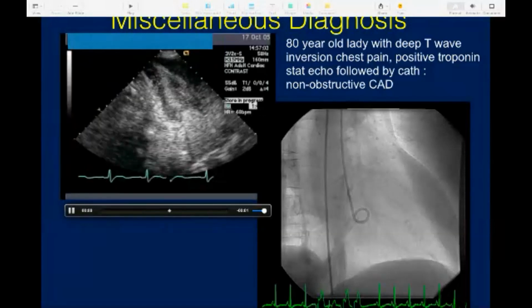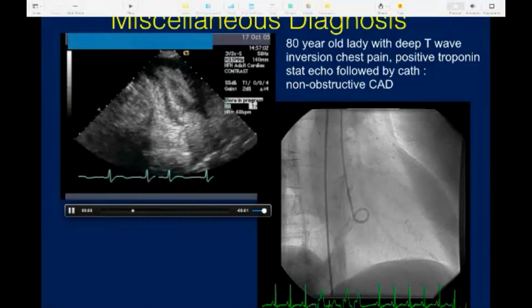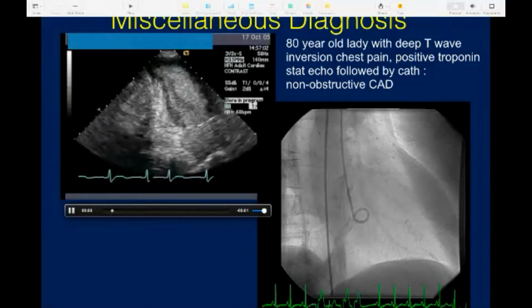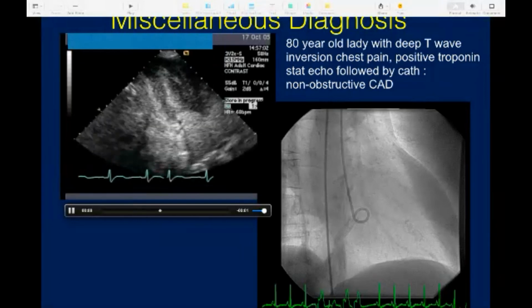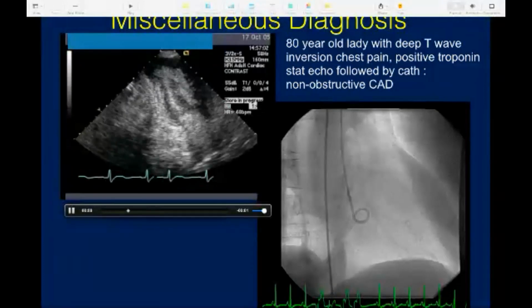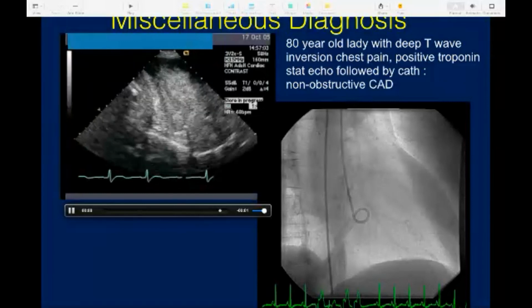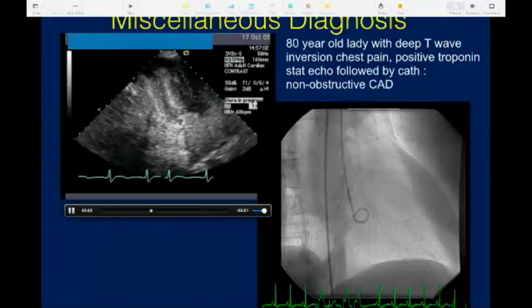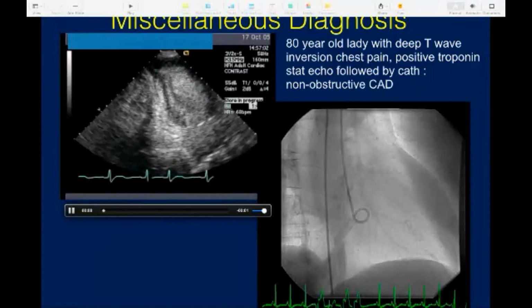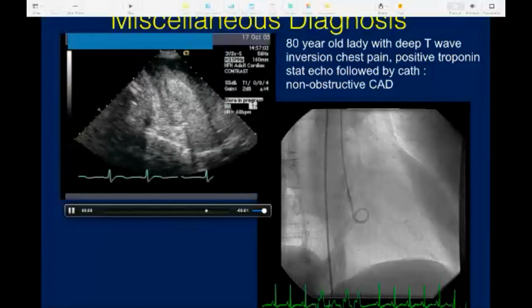Also observe that even though this is not primed for myocardial perfusion, you can see that there are actually bubbles in the myocardium right up to the distal portion, and then there are absent bubbles in the myocardium in the area of wall motion abnormality. And I think this information is available to you in most contrast studies, so you might as well cheat and look at it and say, are there bubbles in the myocardium, which gives you an idea of myocardial perfusion.